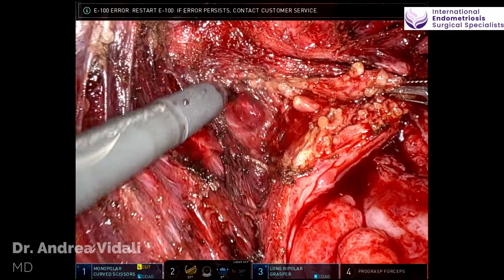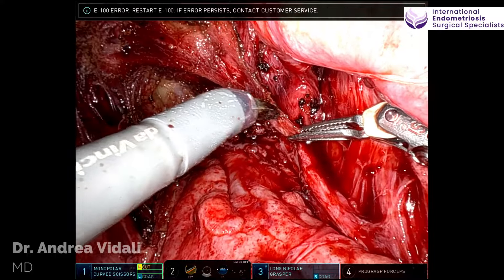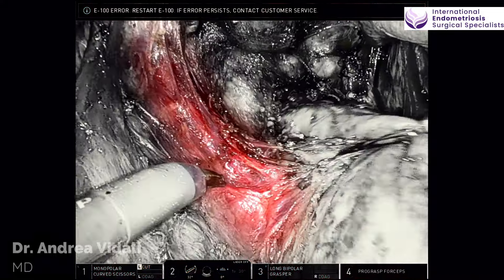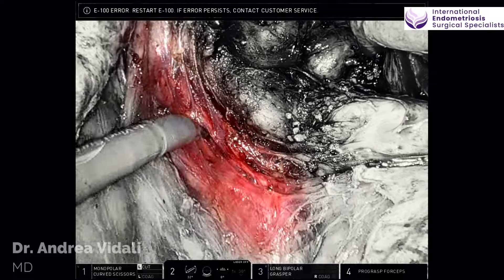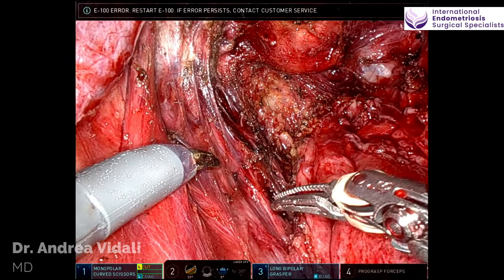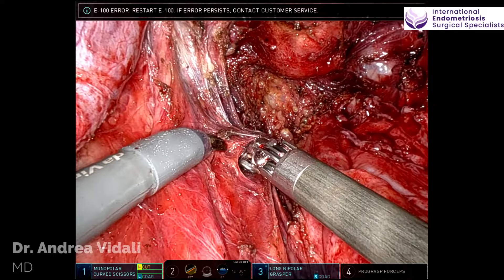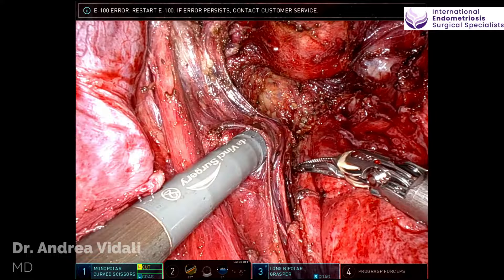There are different fascial layers in the pelvis, and many of the organs, nerves, and vessels are contained within their own fascial layers. Along with that, those fascial layers also include the actual pelvic fascia, which is thicker. As I dissect the nerves in the hypogastric plexus on the left side, you can see that this bundle of nerves, which contains both sympathetic and parasympathetic fibers as well as some somatic fibers, is contained in its own fascial layer.